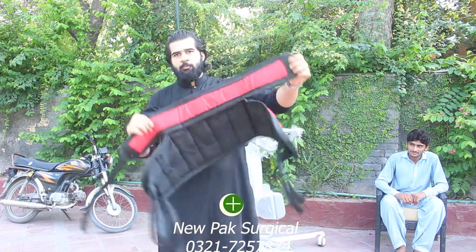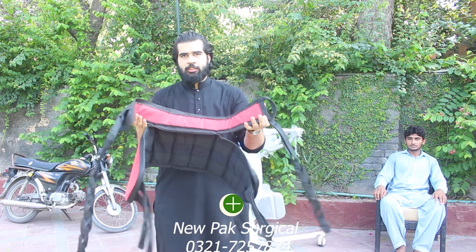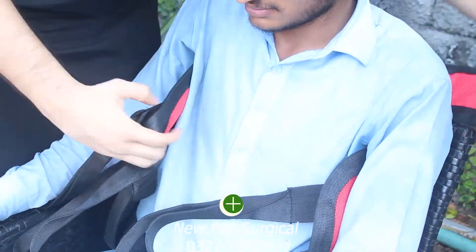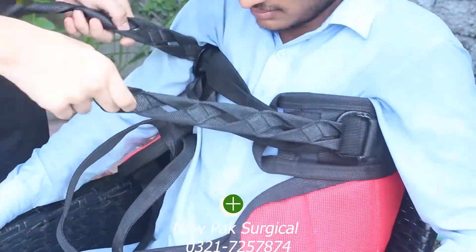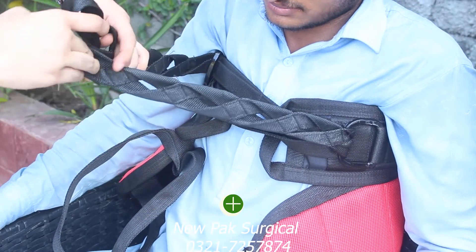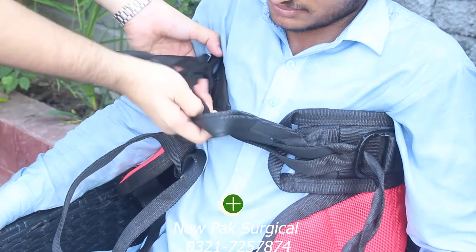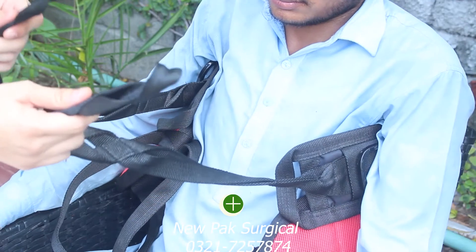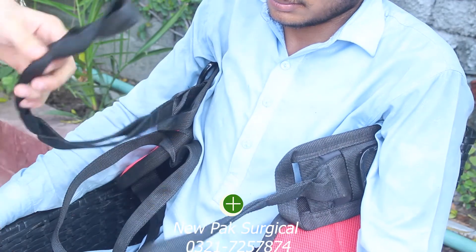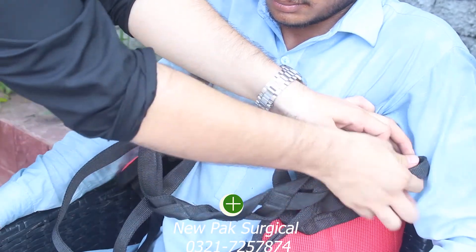This is our sling, which is the patient's harness. I am telling you how to attach it. Now, as we have shown you, I will repeat this. These are two loops and strands, and on the opposite side there is a steel loop. You have to go through it.